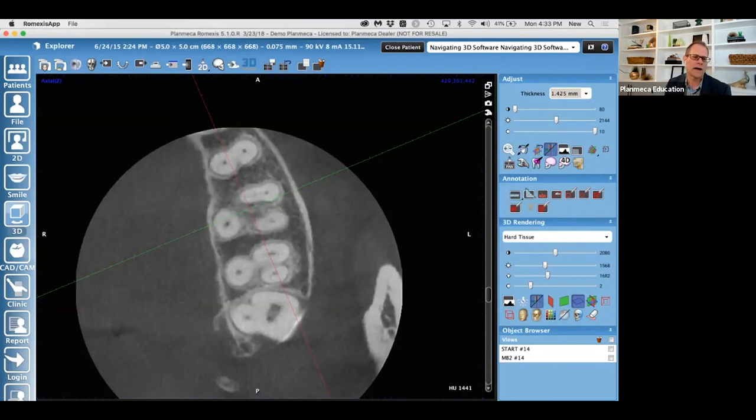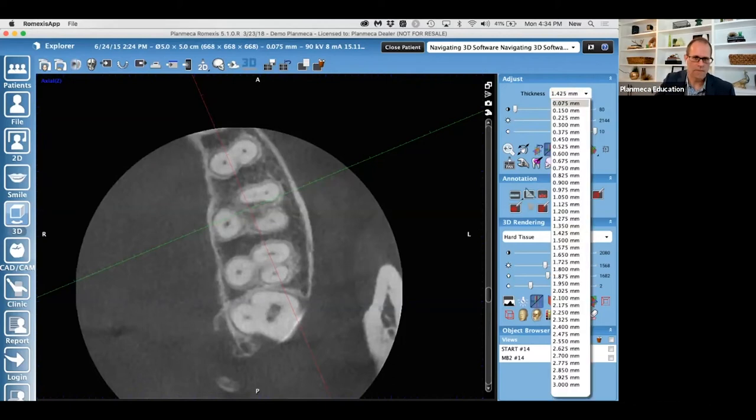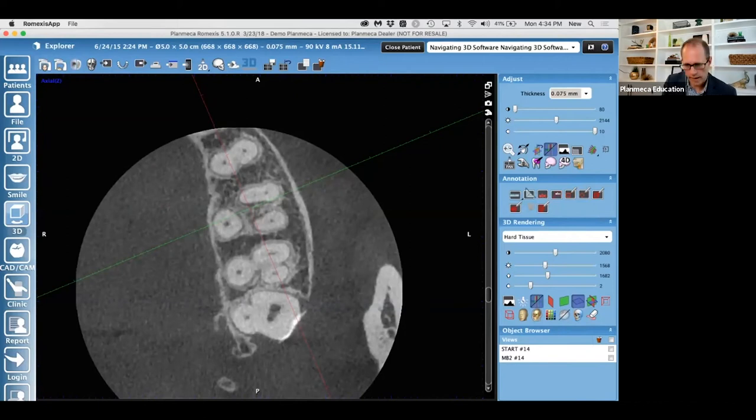The only time I would advise ever taking a high res scan is if you are attempting to possibly look at a fracture. The endodontic community needs high res scans because they're typically either treating a tooth or retreating a tooth. If they're retreating, they may want to see if there was a missed canal, a short fill, or a fracture. Those might be the three things they're looking for, so of course they're going to want to take the highest res scan they can. Here's the problem. If you take a high res scan, you create noise.